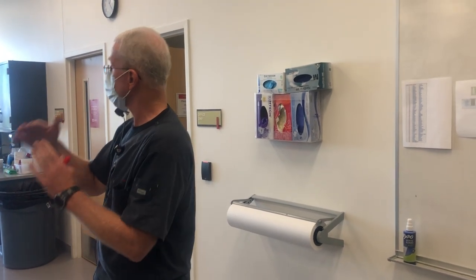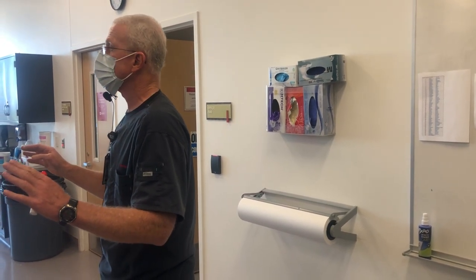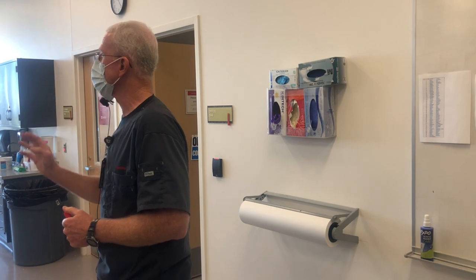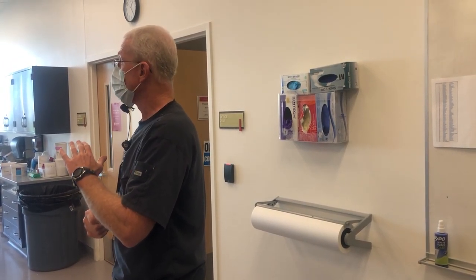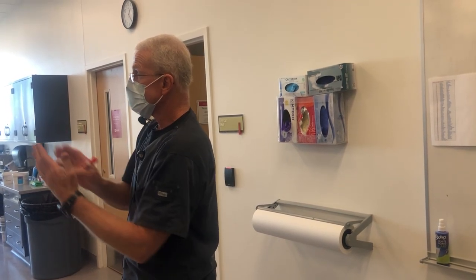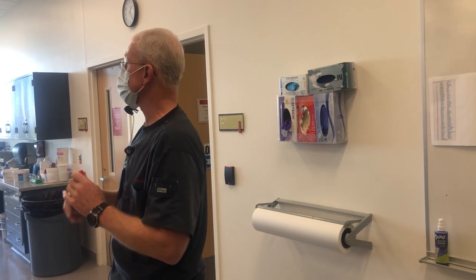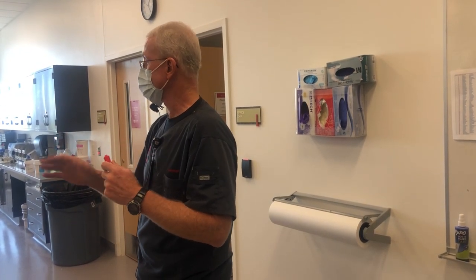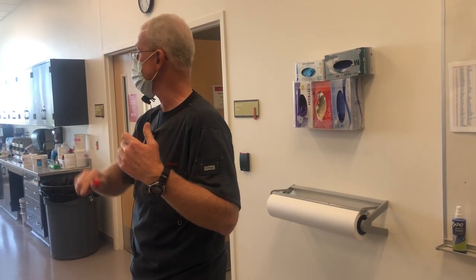It's not so much because you're going to have a hard line with either margin, but oftentimes, and this isn't in every single case, if you had a really dark tooth underneath, let's say the tooth had been endodontically treated 20 years ago with a silver point, and sometimes those roots are dark, and you're trying to mask that with your indirect restoration, the more room you give your ceramist right up by the margin, by the gum line, the more depth they have to block out that dark root, the more effective they're going to be at covering it. So it's more about masking things we don't want to see than it is about creating, like with composites, where a beveled margin is a nice margin. It creates a transition. This is more where we're trying to block things out. So, good question.